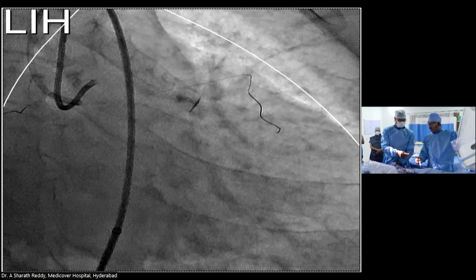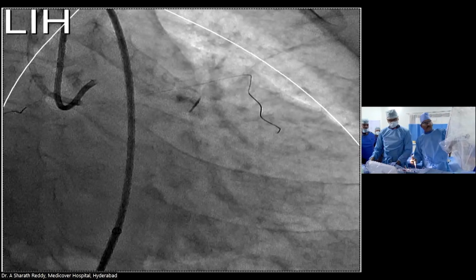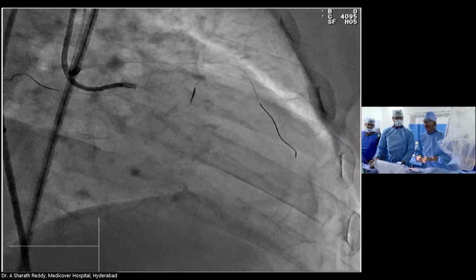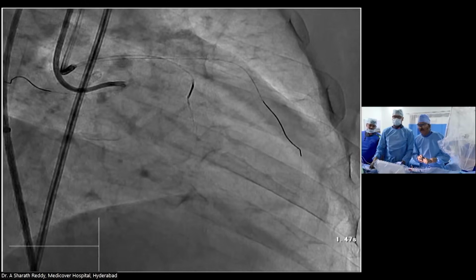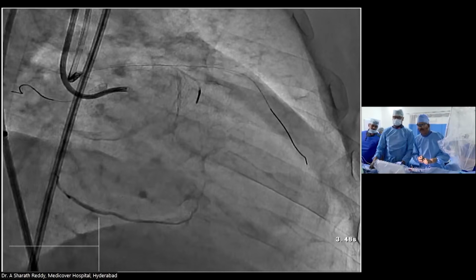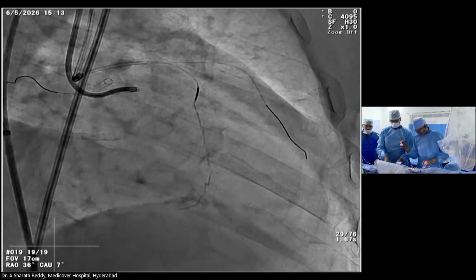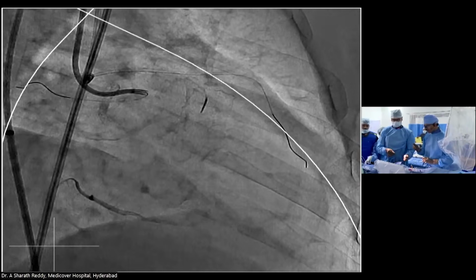Yeah, just a small comment. As the CT angio has given a lot of information, I feel that after CT angio, antegrade is the first choice, because now we know where the proximal cap lies. And after locating the proximal cap with the IVUS, then dual microcatheter will help. Give me one wire in the branch, and a second wire might help.